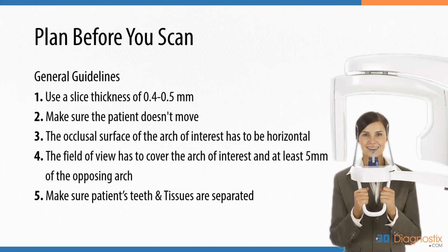Make sure that the occlusal surface of the arch of interest of the patient is parallel to the floor. The patient needs to be looking forward, not up or down, and their head needs not to be tilted to a single side.